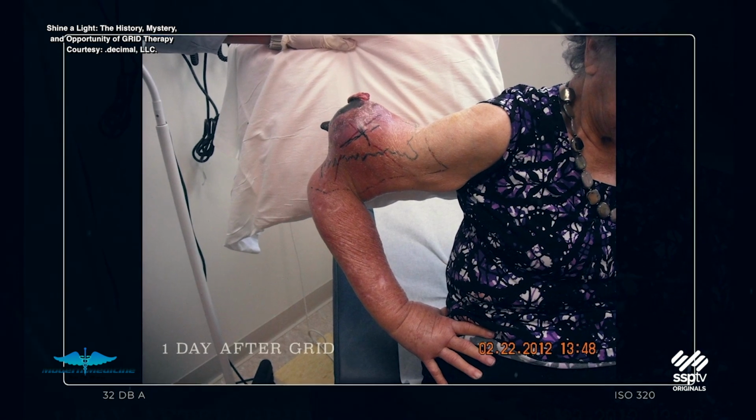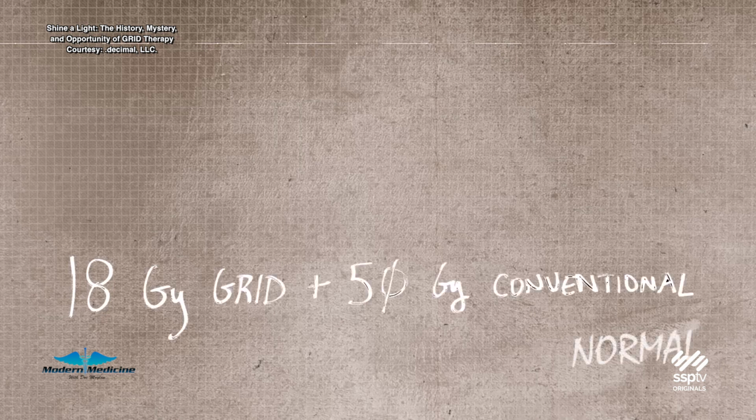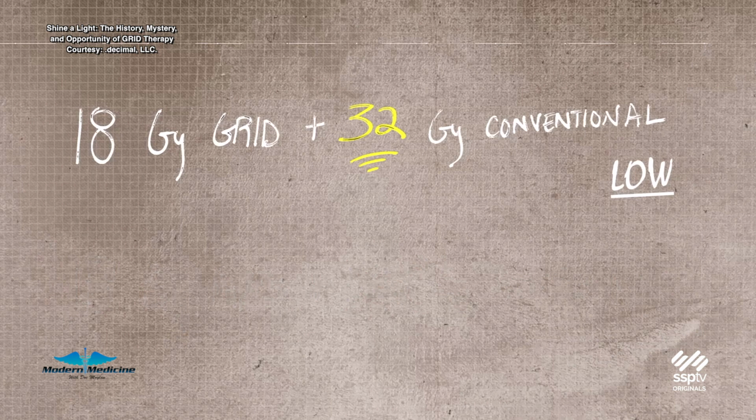What we were supposed to follow that up with is another 50 gray of radiation. That's the conventional standard of care. Well, the surgeon who was involved with this was concerned about doing surgery after such a large dose of 18 gray and absolutely refused to let us go to 50 gray, which is the standard dose. He said, it has to be 50 gray, that's it. To summarize here, the surgeon set an upper limit of 50 gray in total, including the priming grid dose of 18 gray that would normally be given before a full course of 50 gray. In other words, to satisfy the surgeon, Dr. Muhadin had to treat this patient with a much smaller total dose.